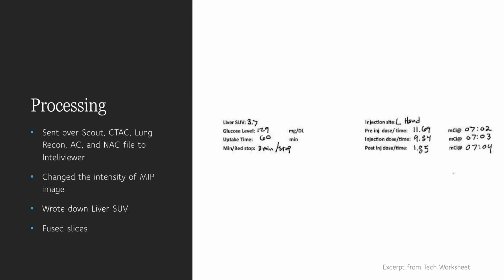And this liver SUV value is used for body background, and it's also used to compare the nodule SUVs that the radiologist measures for diagnostic purposes.